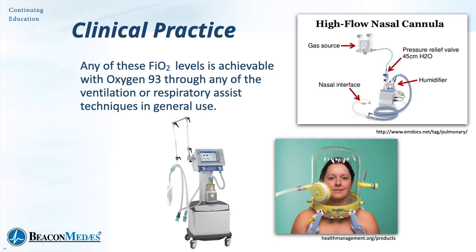Now, what we're seeing is the kind of devices here where we're talking about also very high flow rates. So our traditional therapies that we would do with oxygen might go up to the 15 liters range. With COVID patients, we're seeing some applications up to the 120 liters range. Now, all of that's not oxygen. All of that is oxygen and air, but it's still very high quantities of gas, much higher than we're used to seeing. And that's one of the concerns that we have as we look at our medical gas systems in light of the COVID crisis.